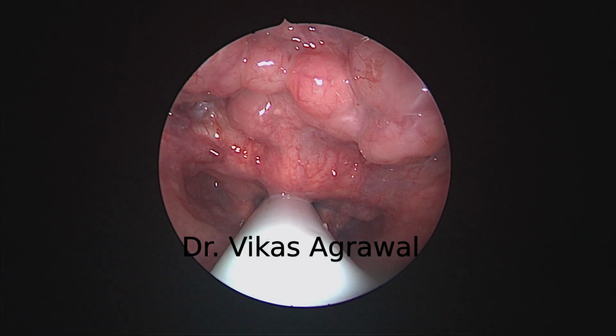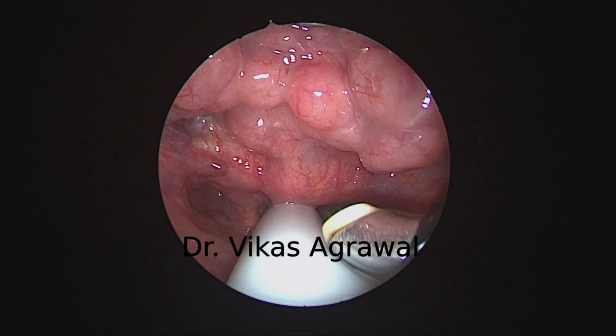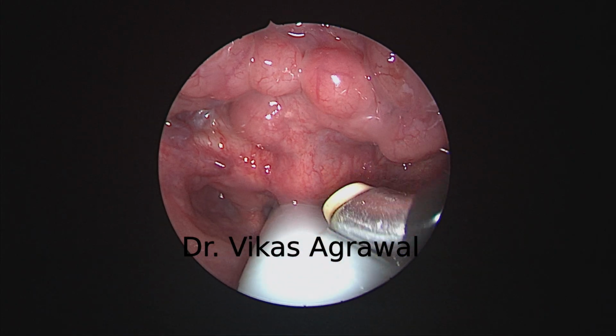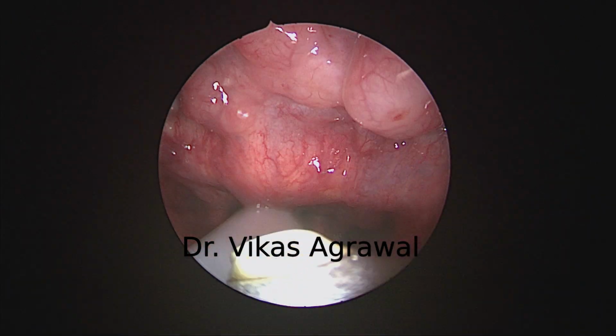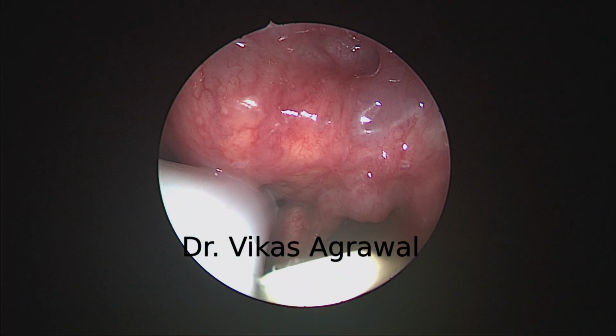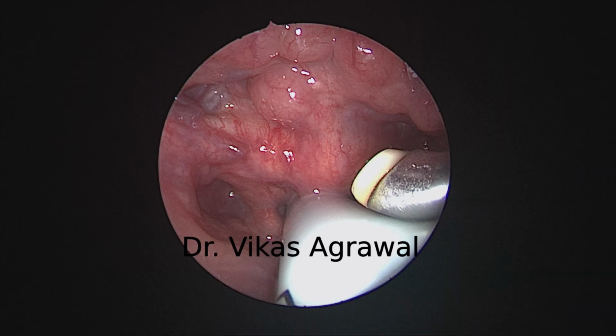So here you are watching Coblation Glossoepiglottopexy in a 37-year-old male. Very bad epiglottic collapse, and you can see the epiglottis during intubation has actually gone inside and got retroflexed. So why am I not removing it now?